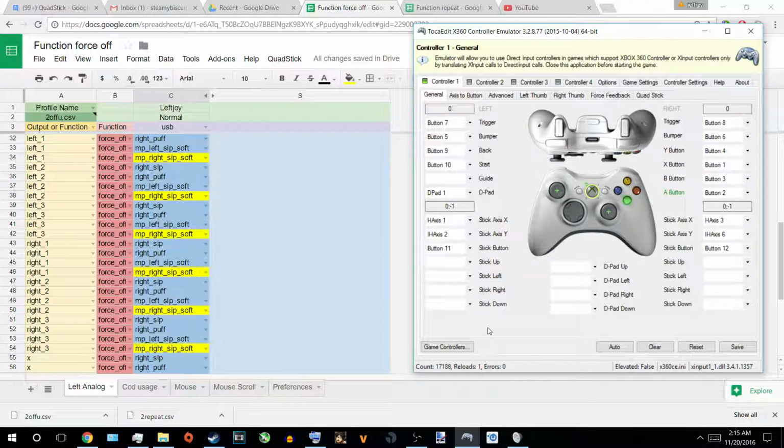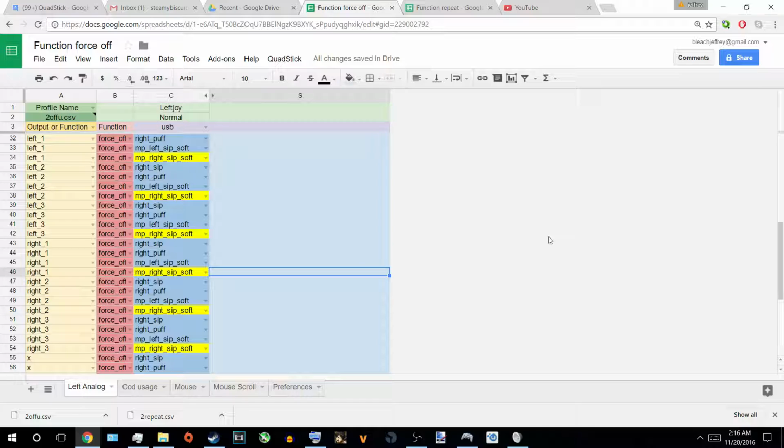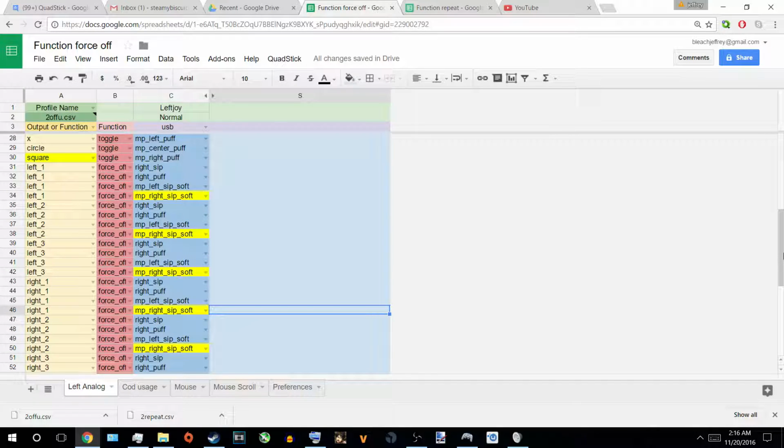So let me turn them all on again. Let's say I'm quickly playing Call of Duty or something like that, and I have things toggled, maybe not that excessive. I've also put the right tube, so I would sip and or puff the side tube, and I set it to also turn everything off. So if I were to go to mode 2, it will turn everything off, and I don't have to worry about it. And when I go back to it, it's still off. So everything's good. Like I said, force off is good for fixing mistakes or preventing them. So I like to use it a lot.